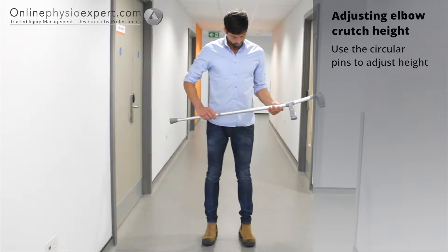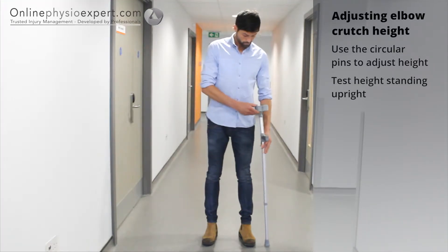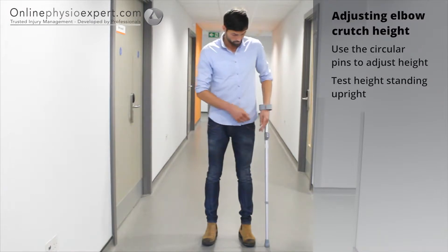Before using elbow crutches you may need to adjust them to the correct height. The top of the crutch handle should lie just below your wrist crease line.